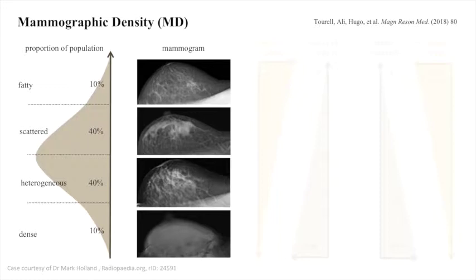First of all, let's examine what mammographic density is and why it's significant. Empirically, mammographic density manifests itself as the degree of radioopacity of the breast on a two-dimensional X-ray mammogram, which is the standard imaging modality used for breast screening. A typical mammogram will have a mixture of radiodense and radiolucent areas. In radiodense areas, the absorption of X-rays is relatively high and these areas appear bright. In radiolucent areas, the absorption of X-rays is relatively low and these areas appear dark. Bright radiodense areas are known as areas of high mammographic density.